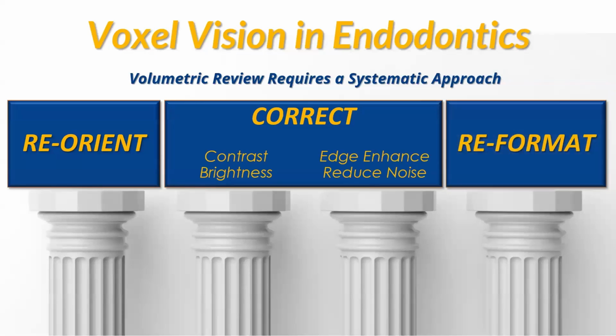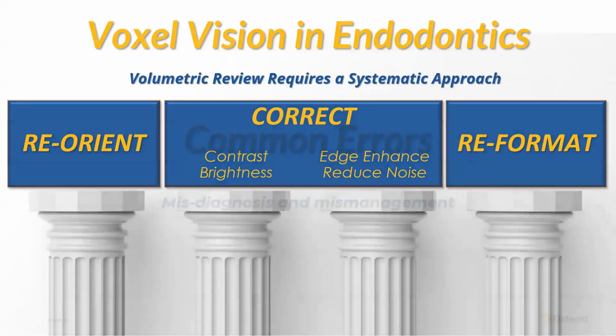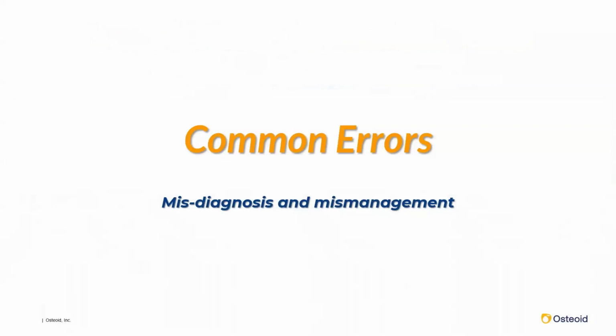The final area is to reformat the data set according to what I would have referred to as task-specific imaging. And today that will be with regard to endodontics. So let's have a look, first of all, at some common errors that we've seen.